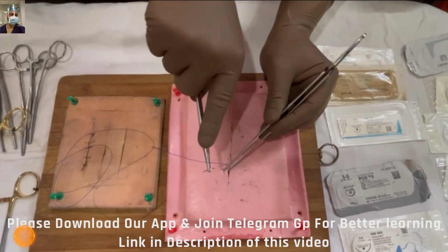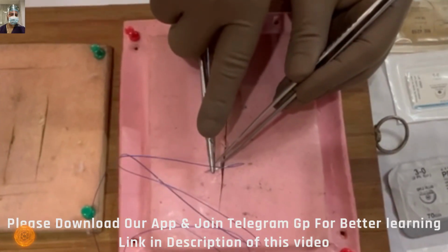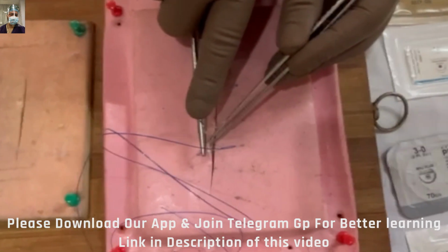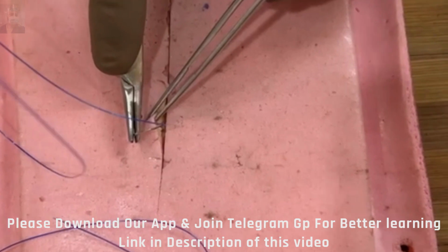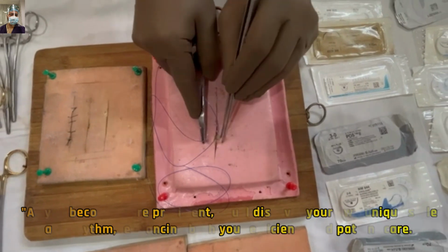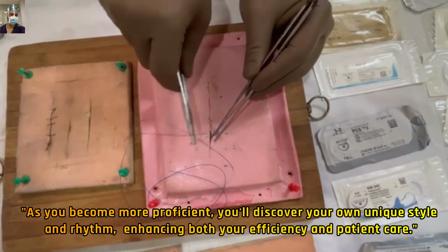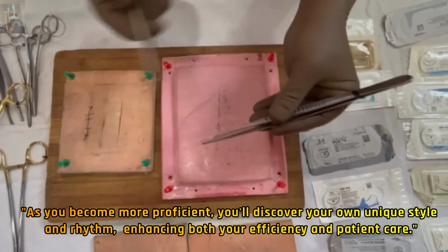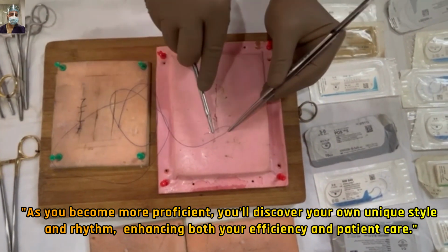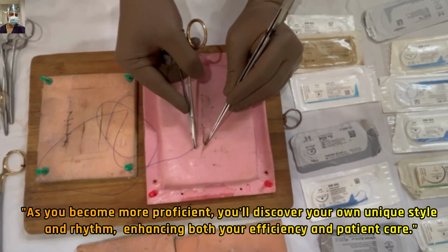So we hit the skin and pass the needle at 90 degrees. Look how my hand is fully prone, and I am not pushing anywhere. I am just following the curve of the needle. So you have to practice these techniques, friends. Watch your thoughts and actions very carefully during the beginning. Whatever you do over time becomes a habit, and these habits over time will define you as a surgeon. So you have to monitor your habits and thoughts very carefully, so that your thoughts become actions, actions become habits, and habits become character. So I have taken the first bite.